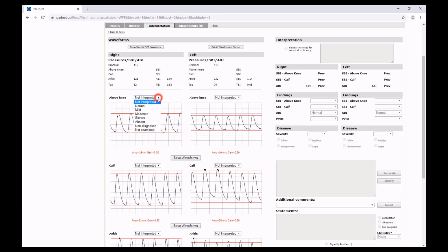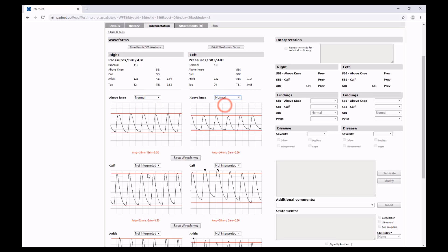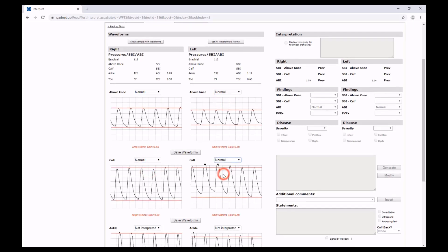To begin your interpretation, go through and select your rating for each of your PVR waveforms.